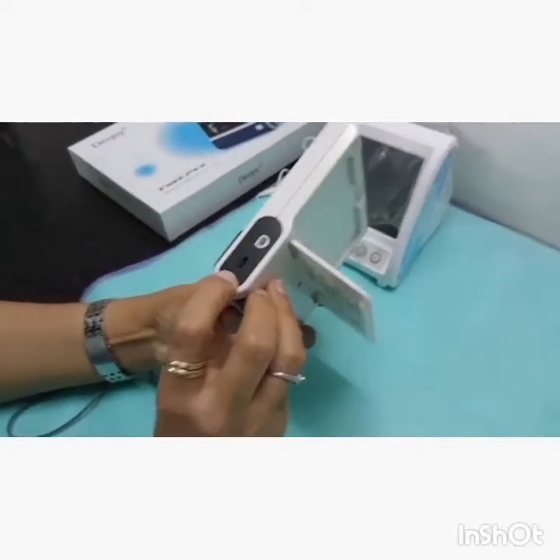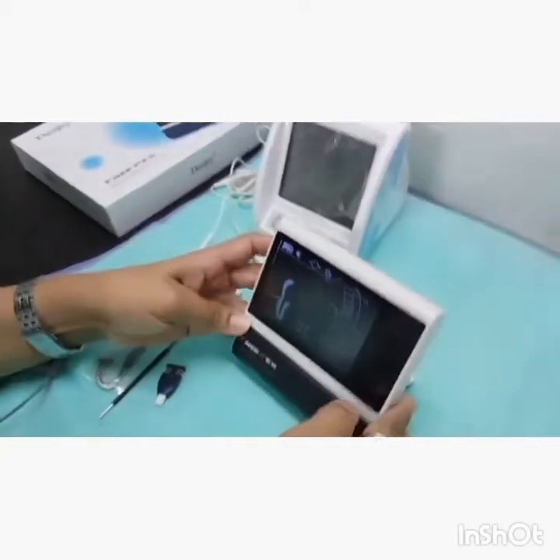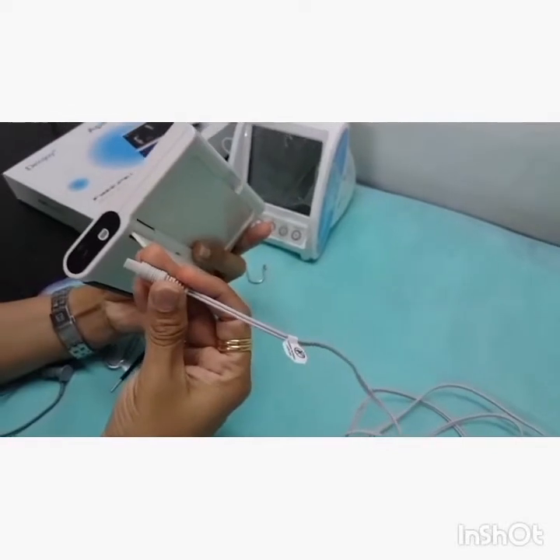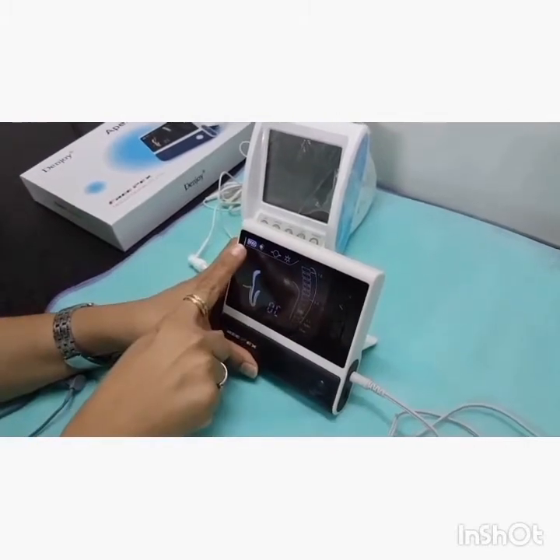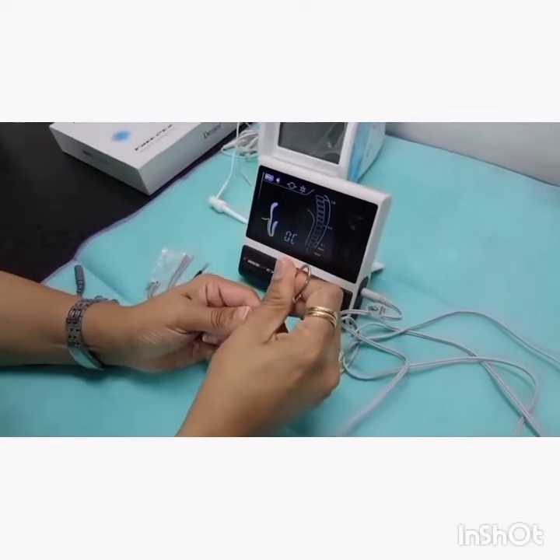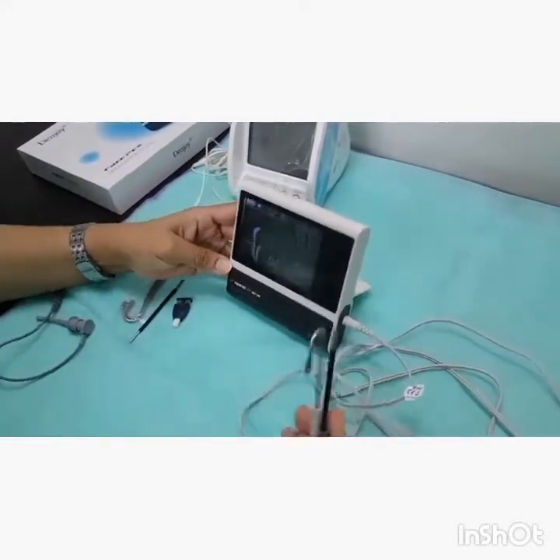The connections for the power charger and for the probe are given at the side, along with the battery. To begin usage, the probe adapter is attached to the apex locator. After switching it on, ensure that it is more than half charged. The lip clip and the file holder are attached into their respective slots, and now the apex locator is ready to use.